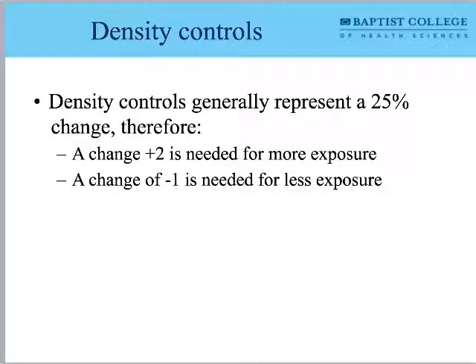We are not centered on the joint. The technologist has centered on the shaft of the femur. Since they were not centered on the joint, I can't see the joint. The joint is where that black arrow is. So it is crucial that we are targeting the AEC on what I would call the anatomy of interest. The anatomy of interest is what should be at my targets.